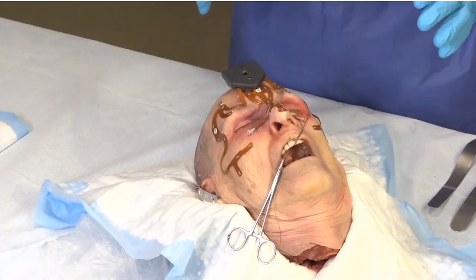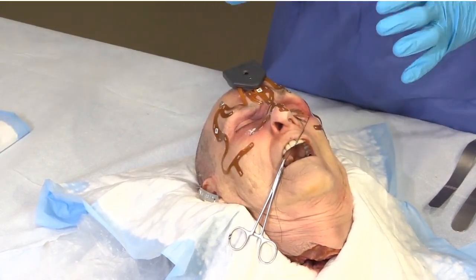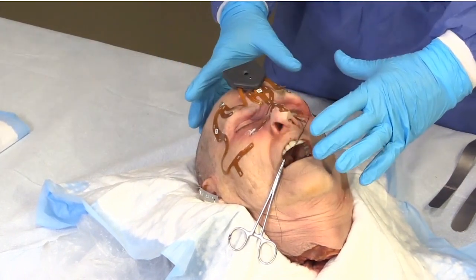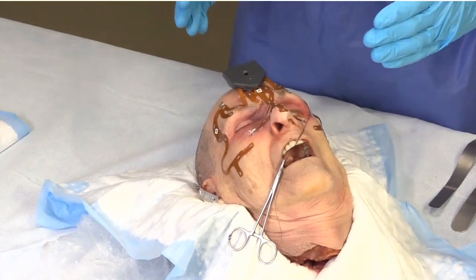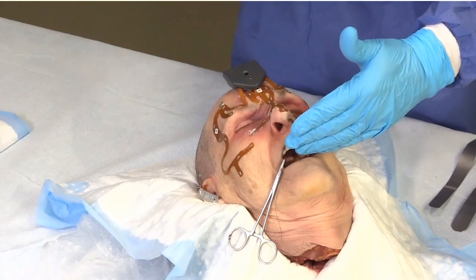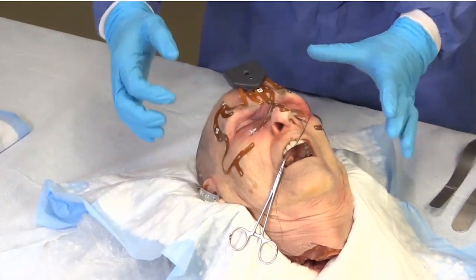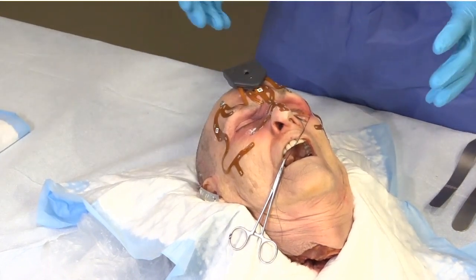In an effort to capture as much anatomical detail as possible beyond your area of interest, you need enough anatomy to register the data sets. You're going to want a CT scan that goes to the vertex of the skull and at least down below the maxillary dentition. That will capture enough area to put a mask on and get enough separation and points for accurate registration.